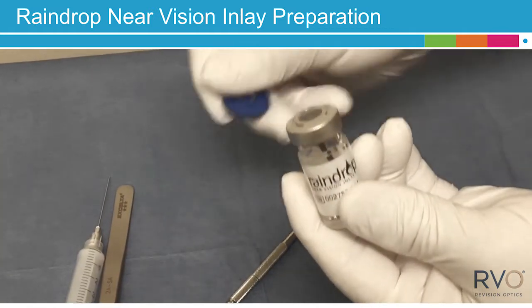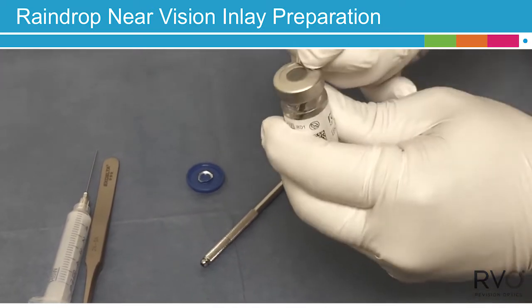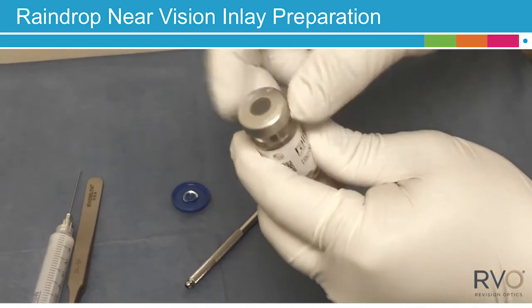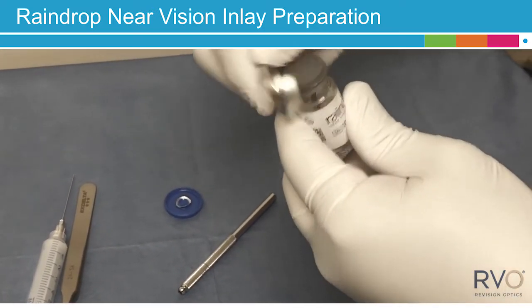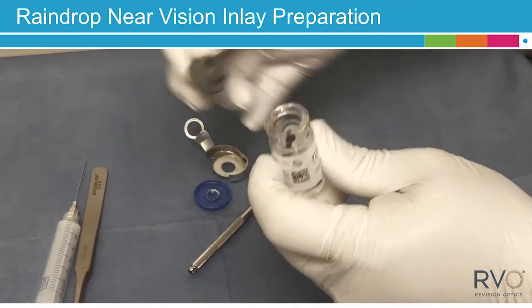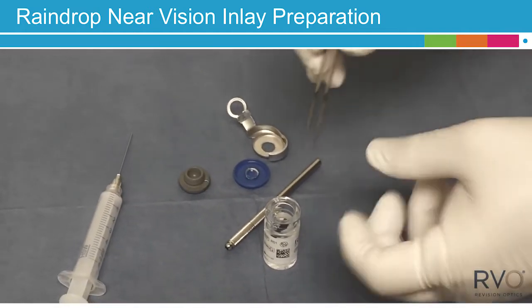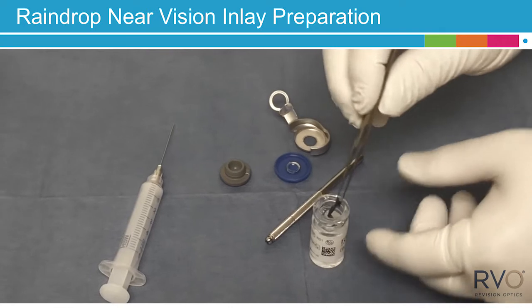Snap off the plastic vial cover and pull back the aluminum ring. Next, separate the aluminum cap, carefully lift up and remove the rubber stopper from the top of the glass vial. Carefully remove the pre-loaded Raindrop inserter from the glass vial using the sterile forceps.